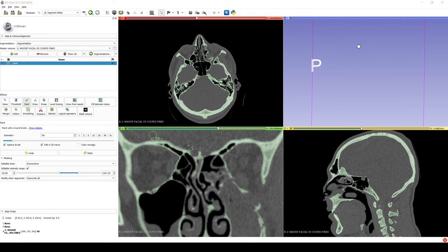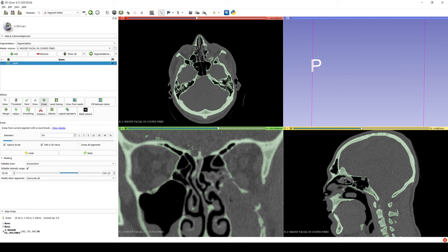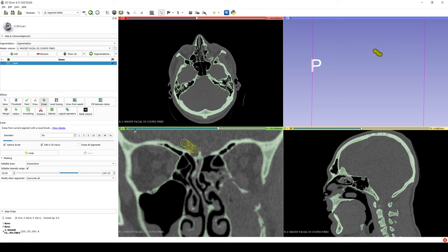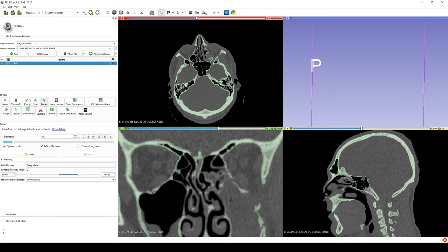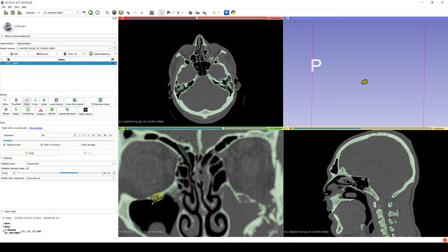If you go past the lines, and it's important for your print, you can use the Erase function, which acts like the opposite of our Paint icon, to erase any of the parts that you don't want to include.